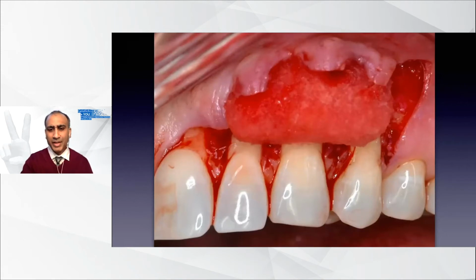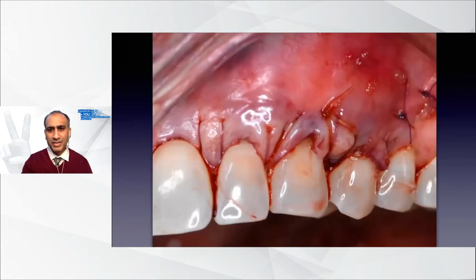So I persevered. After deepithelializing the interproximal papillas, I obtained tension-free primary closure. Now, I can tell you that this was more effort than I thought it would be. So keep in mind that your autogenous tissue and other matrices have maybe a millimeter, millimeter and a half to 2 millimeters thickness, and getting coronal advancement is relatively straightforward. But now when your material is 6 to 8 millimeters thick, all of a sudden this becomes almost like a GBR now, where you're really having to get good release. Nonetheless, we got good release here, and we covered and submerged the material completely.